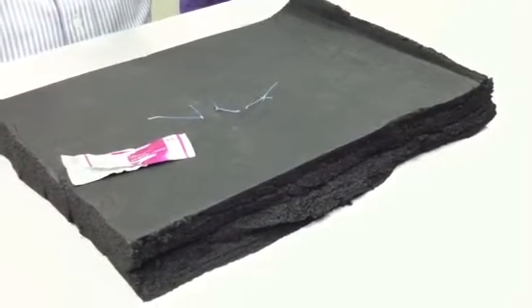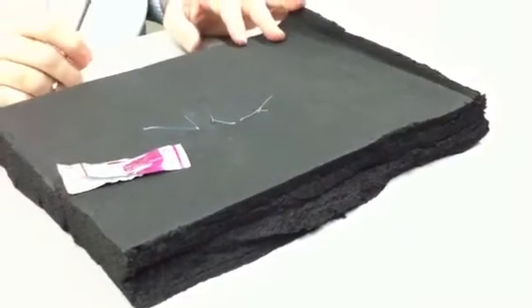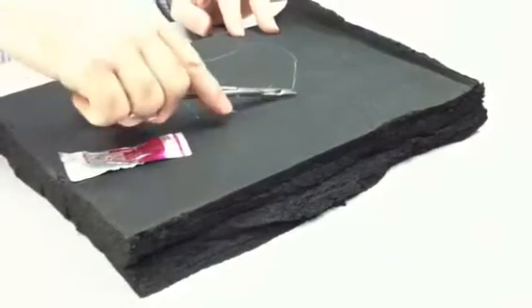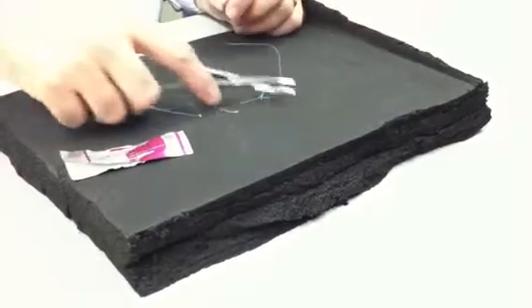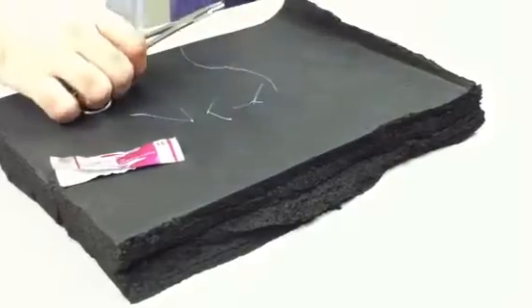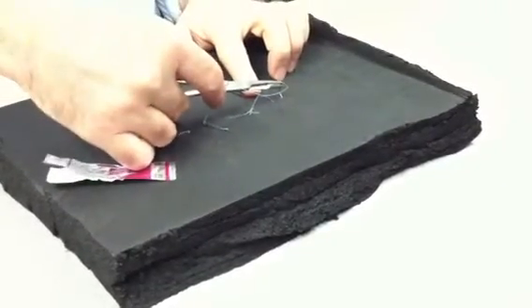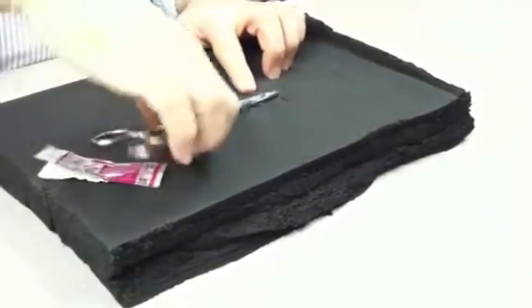Now we'll practice the cruciate and the horizontal mattress, because they're almost the same thing. Remember that cruciate was two forehands? Well this is a forehand and a backhand, so we're going to learn a backhand next. Always start with a forehand — life's easier that way. Forehand, curl that out, gather. Now instead of a forehand again, I'm doing a backhand. The backhand means instead of the curl of the needle towards me, it's got to be away from me in the needle holder.